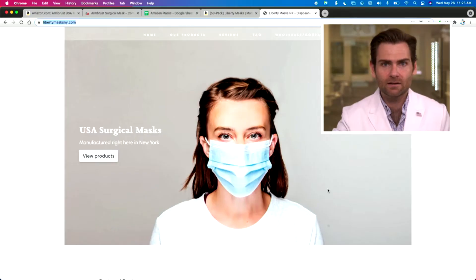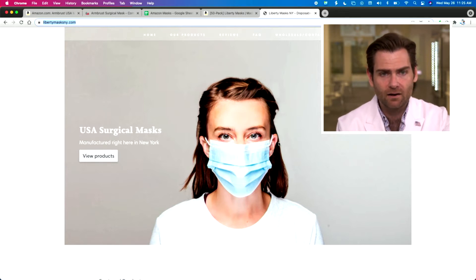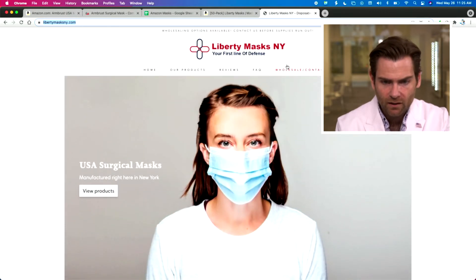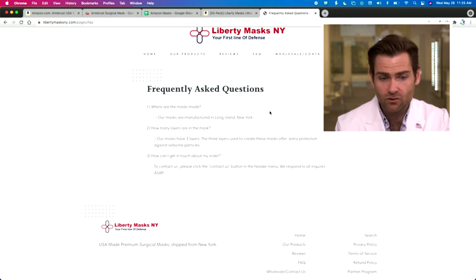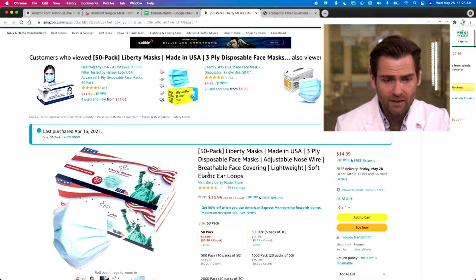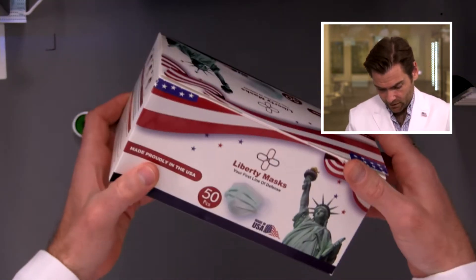Let's talk about this mask. I love the box — soft touch. I have not had a single soft touch box today from America. Level it up, guys. USA surgical mask. You can go to libertymasksny.com — that's their website. I kind of like their website; their design is pretty nice. It looks like they're made in Long Island, New York. We bought these on Amazon and they're not making any claims on the box.